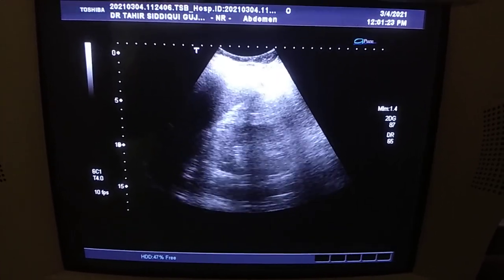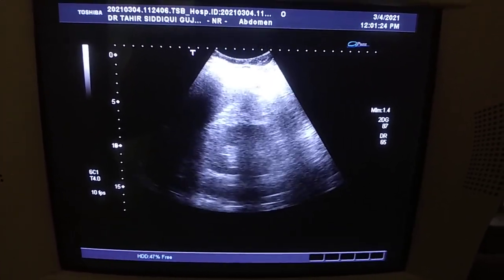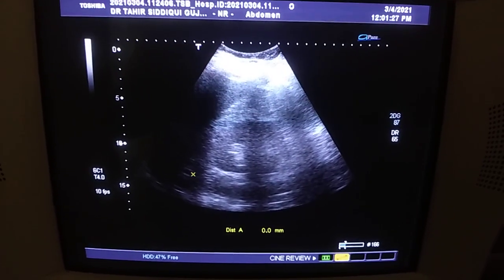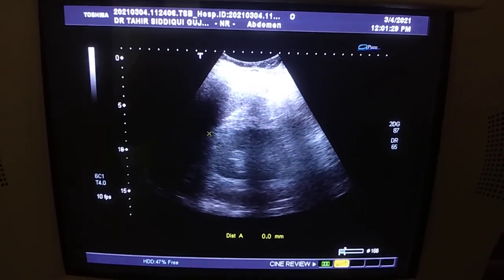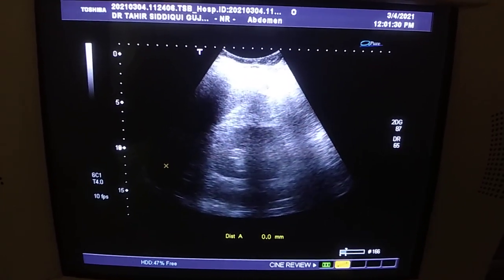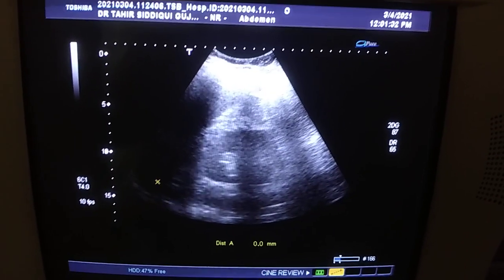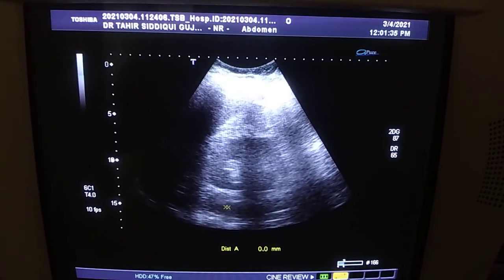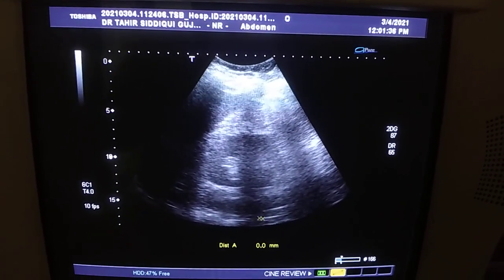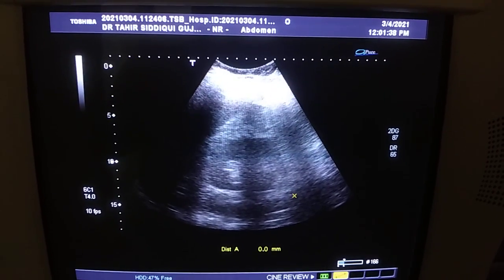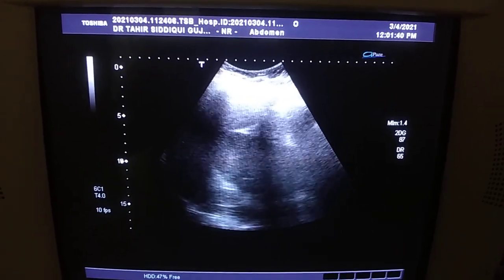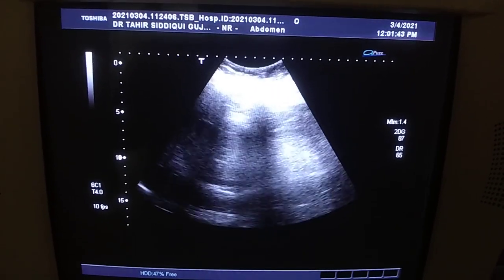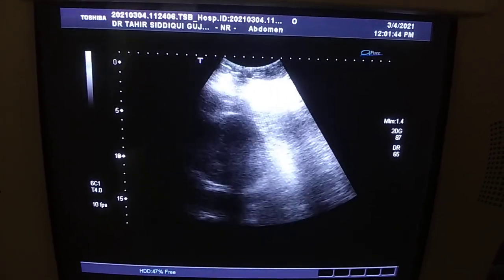Now here you are seeing — I want to show you the IVC first in this image. This is the kidney, this is the liver, this is the diaphragm, and here what we see is the IVC. It is patent; there is no clot or any other pathology seen relating to it. A normal curve, normal caliber.